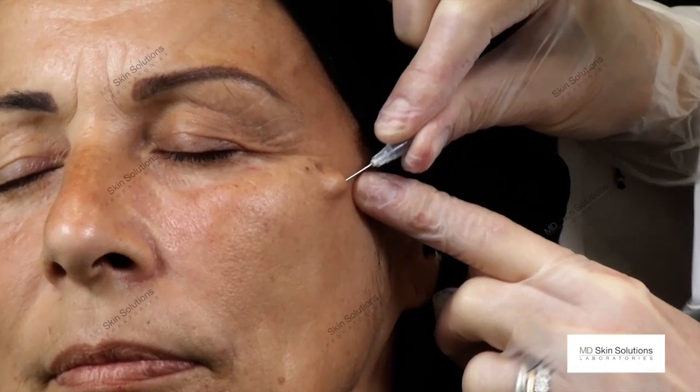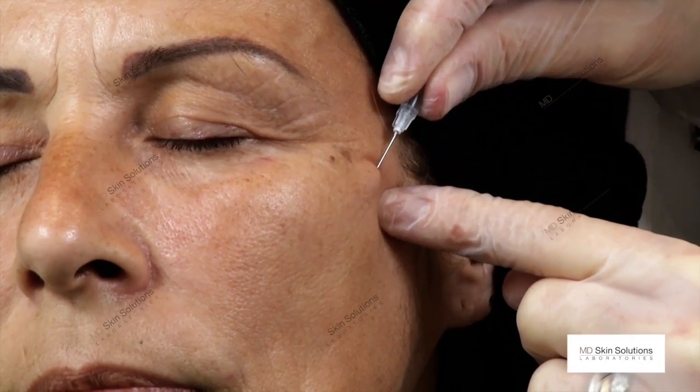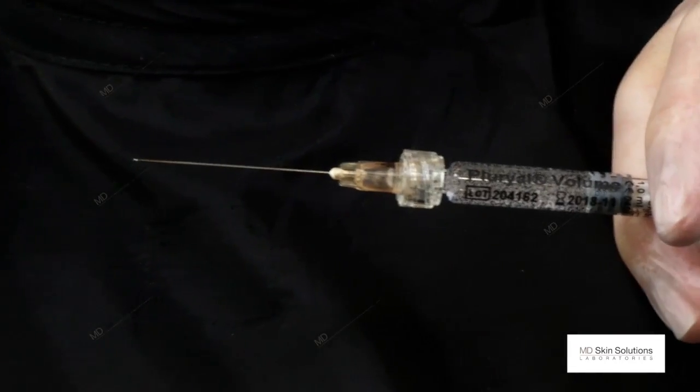First trick is tunnel the way the cannula will move on later. The non-sterile area, because we never want to touch any non-sterile area with our cannula. We're using a 25 1.5 inch blunt cannula.